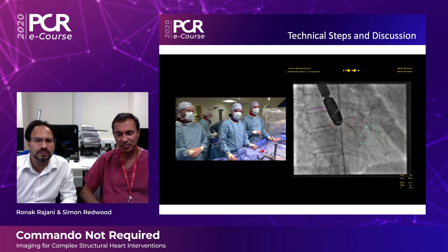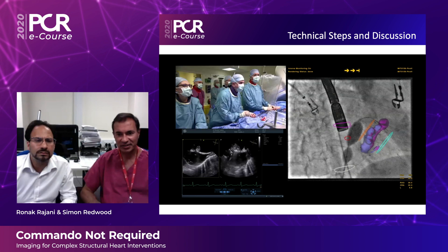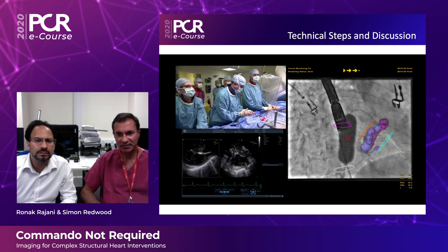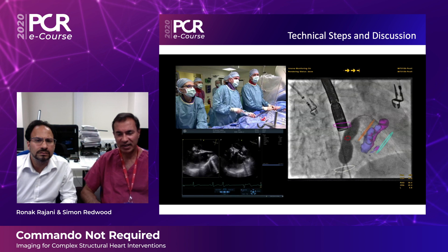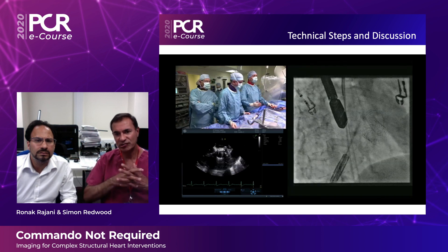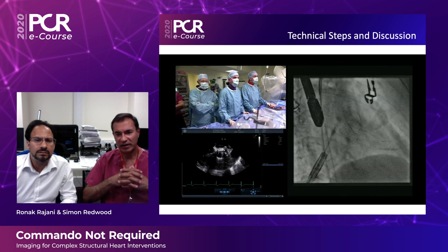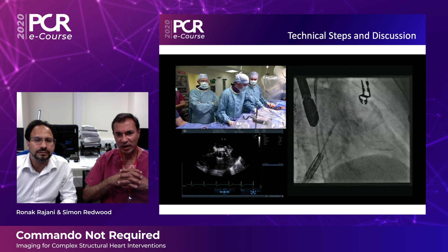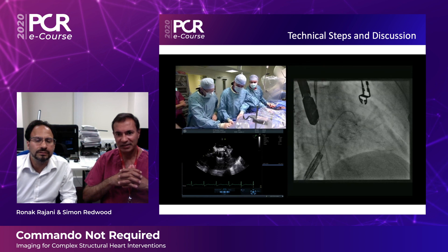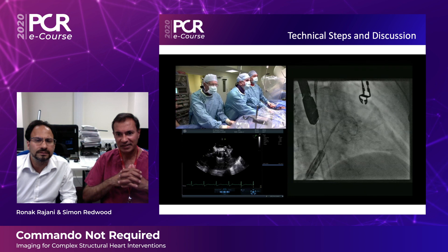This is ballooning the septum in order to create a hole big enough to introduce the Sapien valve. I had a lot of difficulty getting the Sapien valve around that bend toward the left ventricle, so I had to snare the wire in the left ventricle from the other leg and pull that wire through in order to create a rail to bring the Sapien into the MAC.